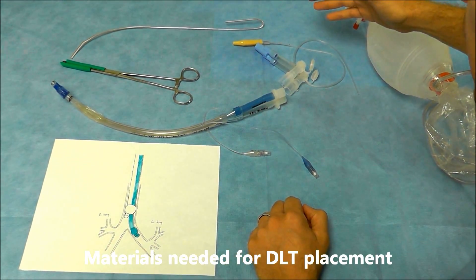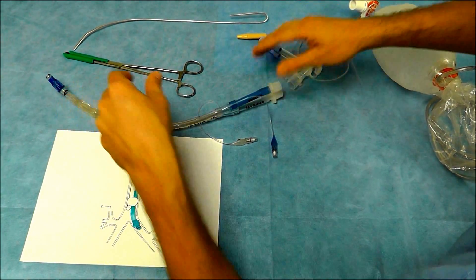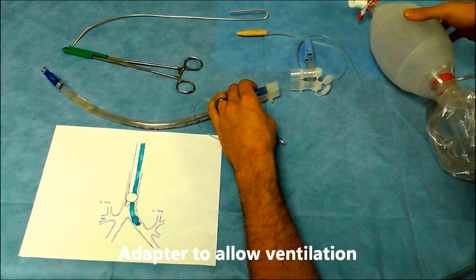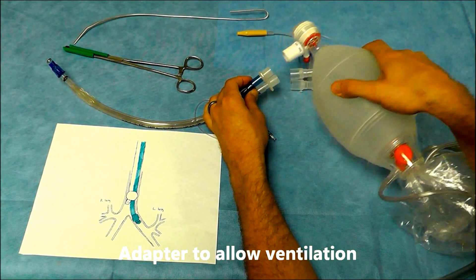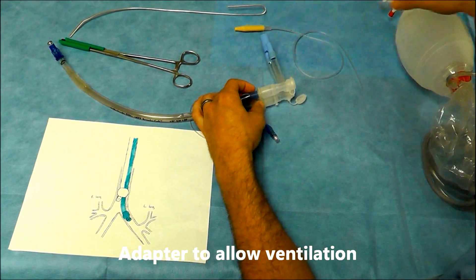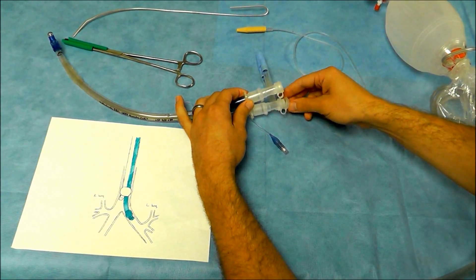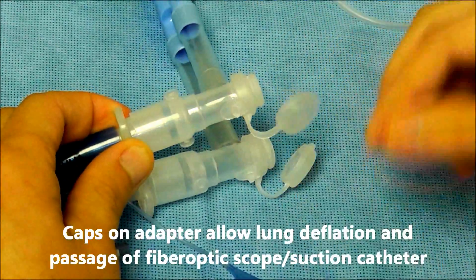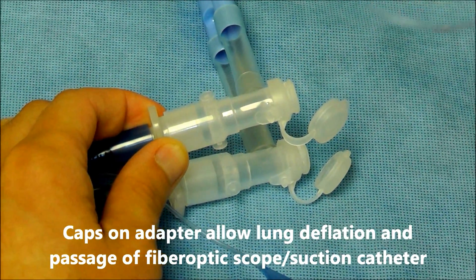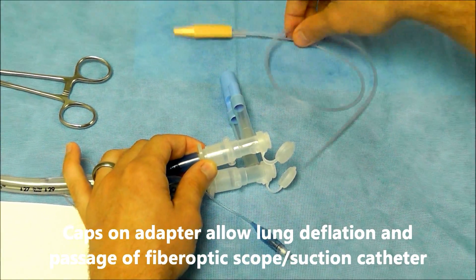The materials you're going to need before double lumen tube placement include the actual double lumen tube itself. The next thing is a specialized adapter that allows you to ventilate both lungs simultaneously. This adapter has specialized caps that open the lungs to the atmosphere and also allow passage of things like a fiber optic bronchoscope or a suction catheter.